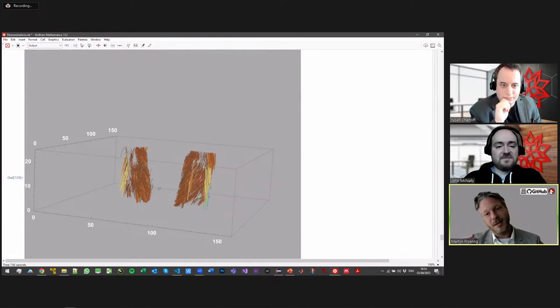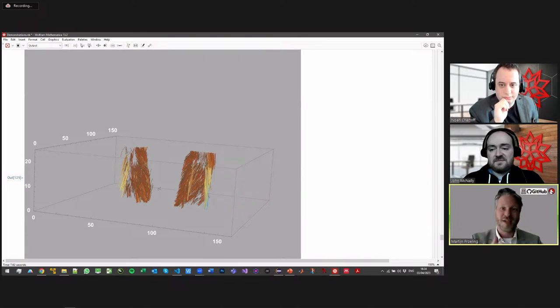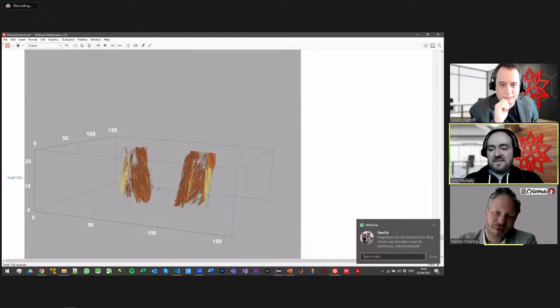And the nice thing is that once all these things are thoroughly tested, you can just hook them all together. So one of these process scripts will actually be me just calling import, process, fit, analyze, do tractography, extract muscles, those steps. And then it's a script, and you have something automated. But of course, each of these functions individually takes quite a while.